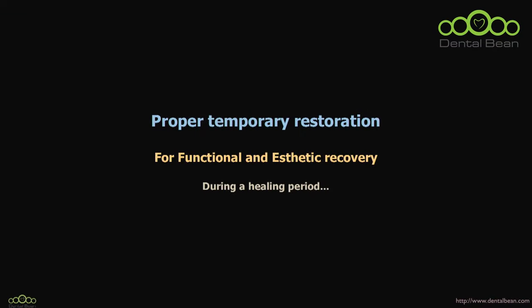And here, let me ask you a question. From the prosthetic point of view, what is your biggest concern right after placing implant? I think without second thought, you will answer that is about the temporary restoration during a healing period for recovering functional and aesthetic aspect. So at this time, I'd like to talk about the kinds of temporary restoration.